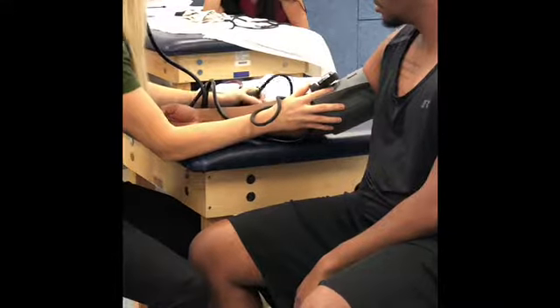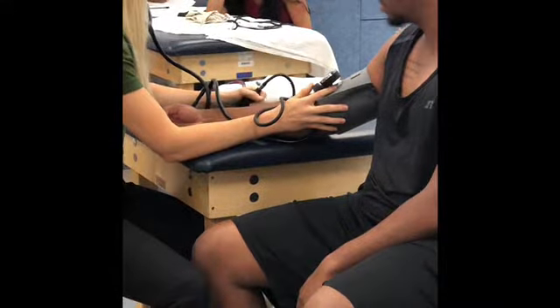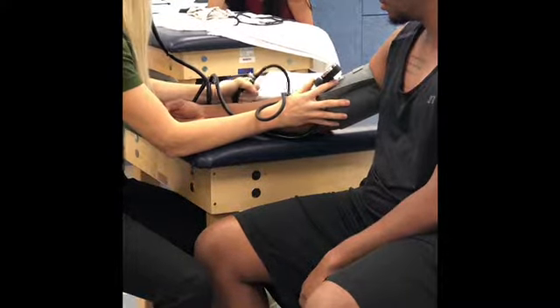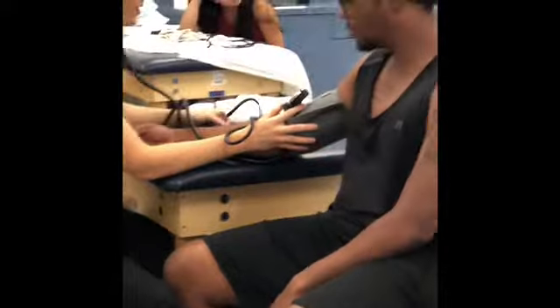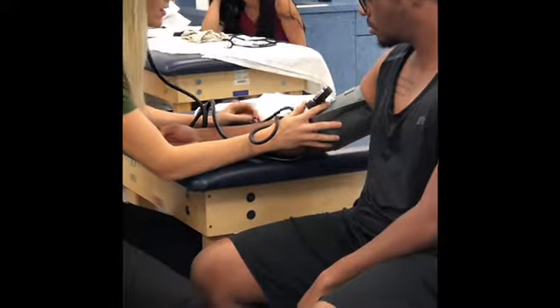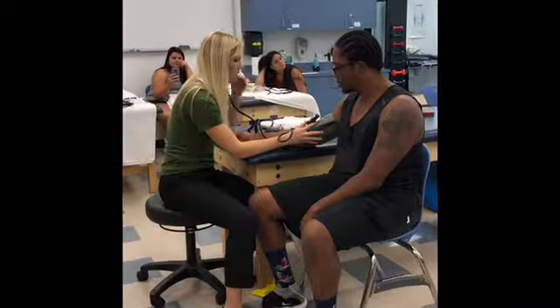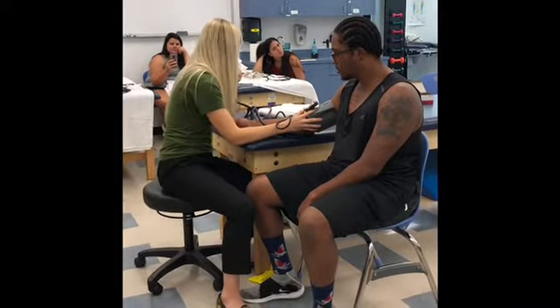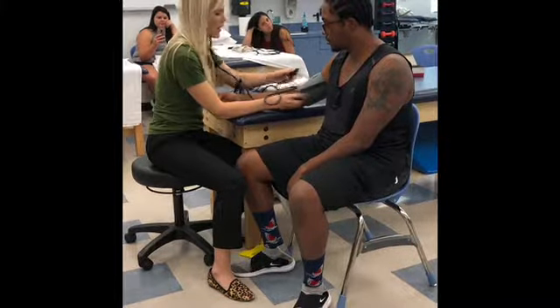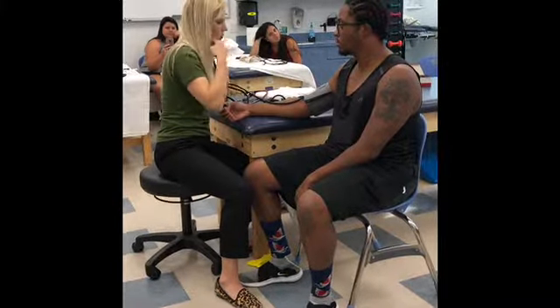Okay, so it's going to get a little snug here. So check your blood pressure. Again, inflate it, deflate slowly. Check my numbers. Alright, so Dr. Reed, it's 118/76. Q, that's great. That means you don't have any high blood pressure, no issues, and we can work with you today.